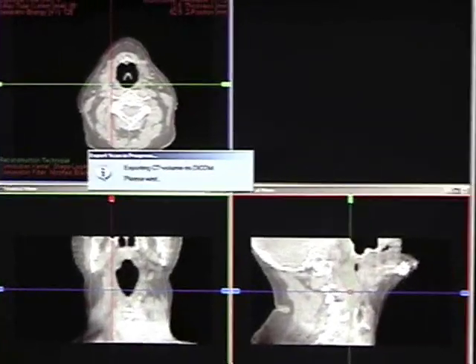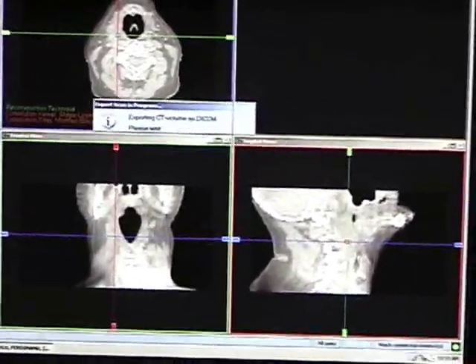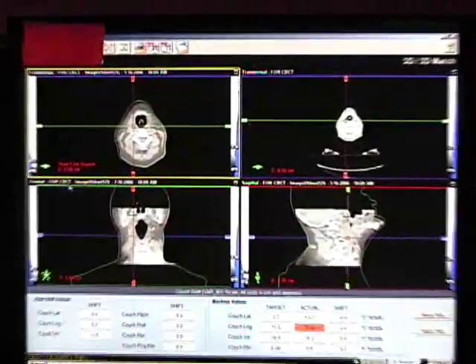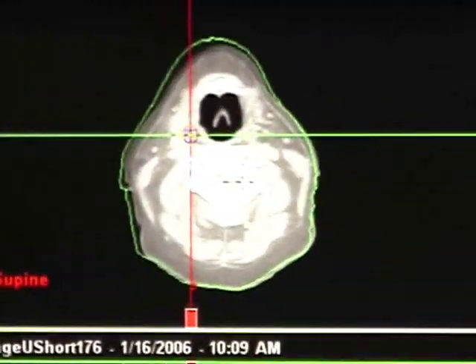That looks very good. I try to find a grayscale. I'd like to review that for sure. But yeah. Okay, now this is cone beam. Cone beam is being shown here.